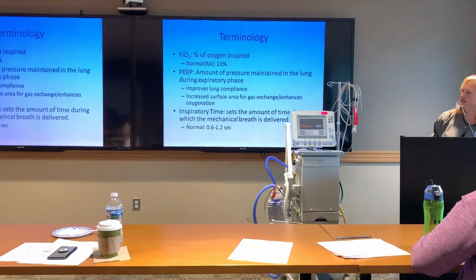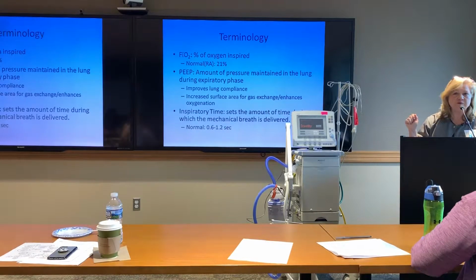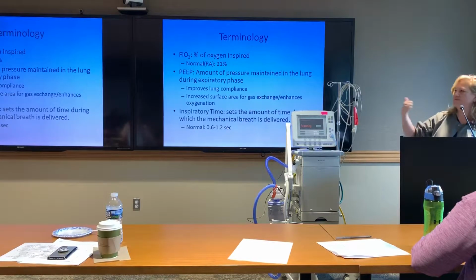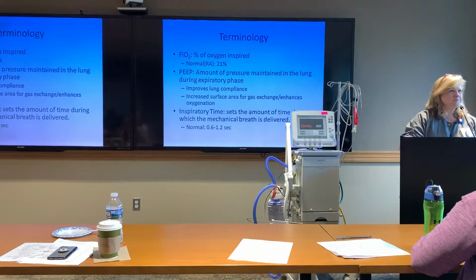Speaking of FiO2, there we go. You guys all know that's the amount of oxygen we breathe in. Hopefully you all know that room air is 21% and the max that we can do is 100%. That's good. What you may not know, and this is just a helpful tip, yes sir?